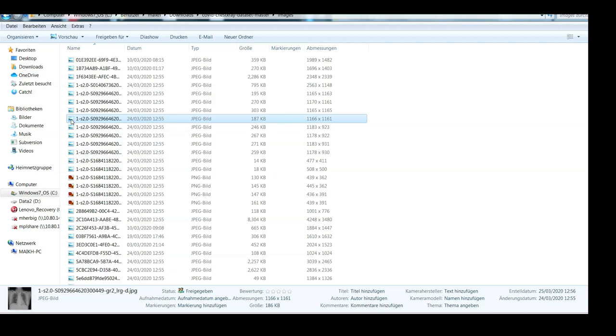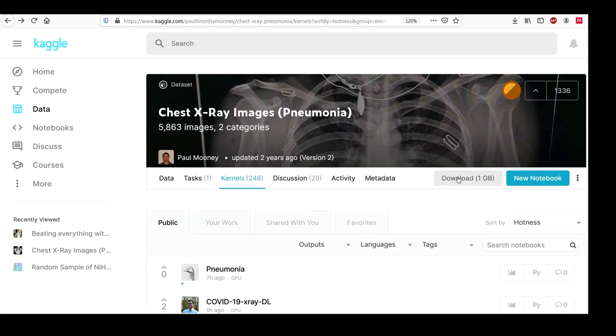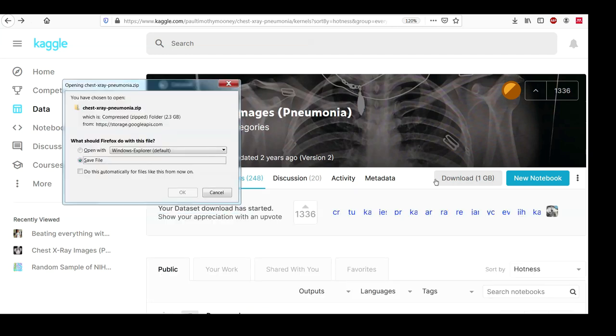While looking for a dataset that is different yet tries to solve a similar task, I stumbled upon this Kaggle competition where they want to detect pneumonia in X-ray images. Therefore I logged in with my Kaggle account and downloaded this dataset.